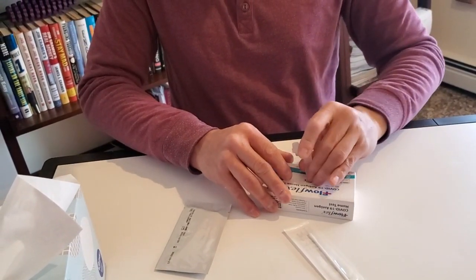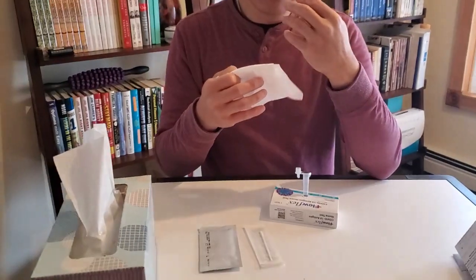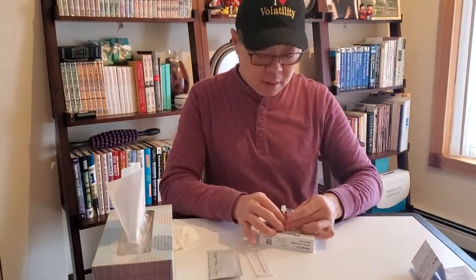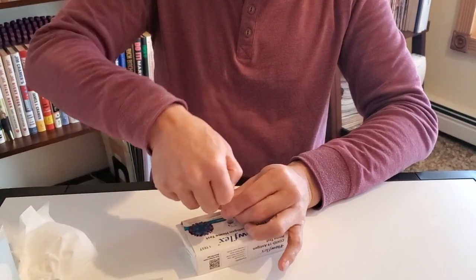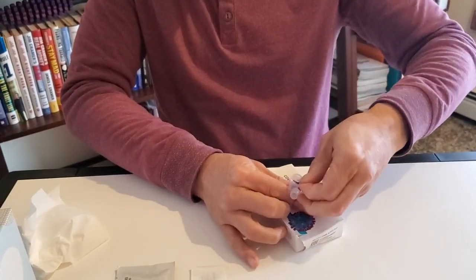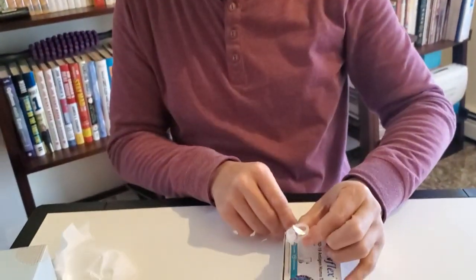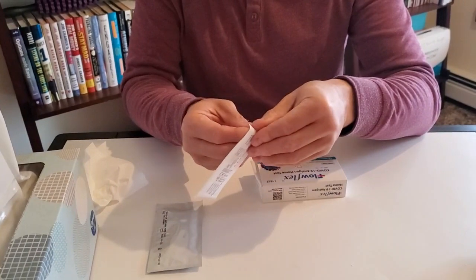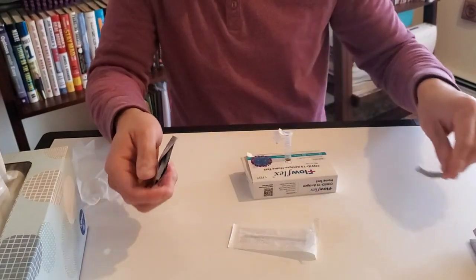One thing the instructions don't tell you is to blow your nose — and I've seen a lot of videos that do that. It's because blowing your nose basically moisturizes around your nose so you have mucus in there, and that's what you want. Open up the swab tab partially so it won't be contaminated. You don't want to take the tester out until the last moment so it's not contaminated.